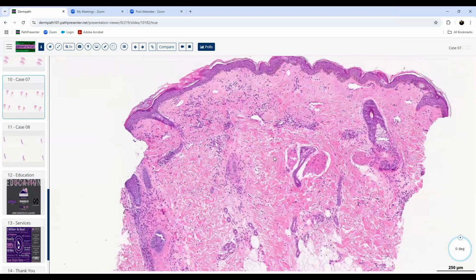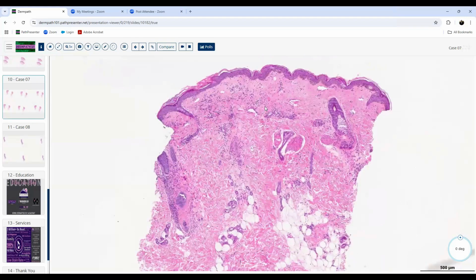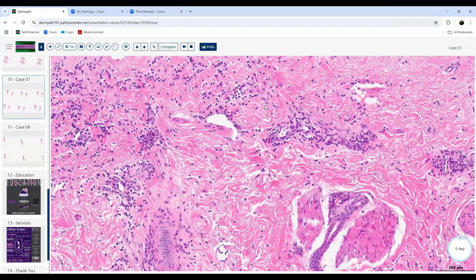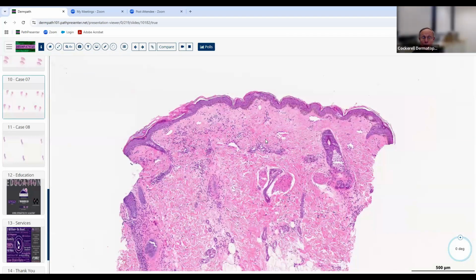Sclerosis. Morphea, yes, the inflammatory stage of morphea. Inflammatory morphea, early morphea. It might not even feel thick yet. But whenever you see that pinkish lilac color, when you biopsy that, this is what you see. When you biopsy the really thick ivory looking lesions, those are going to give you the square biopsy with the diffuse sclerotic collagen.